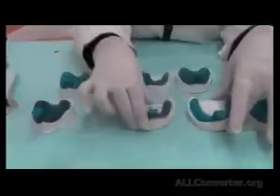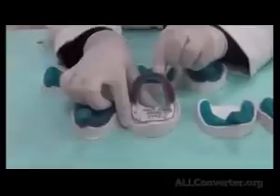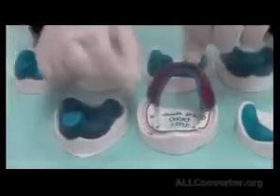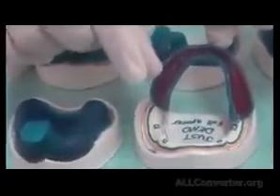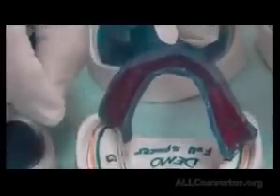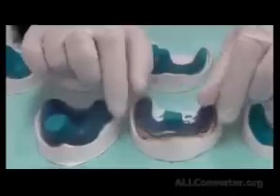The other option is that the technician might deliver the trays with a full spacer in place. This full spacer will be maintained until we finish what we call border molding. But once we want to take the impression, we're going to remove this spacer material. Removal of this spacer material will allow sufficient thickness of impression material. The impression material will not be pressed against the tissue a lot. It will be pressed, but with minor pressure. This minor pressure will not cause any displacement of the tissue, and this is called a mucostatic impression. So taking a secondary impression using a tray with a full spacer will be a mucostatic impression.